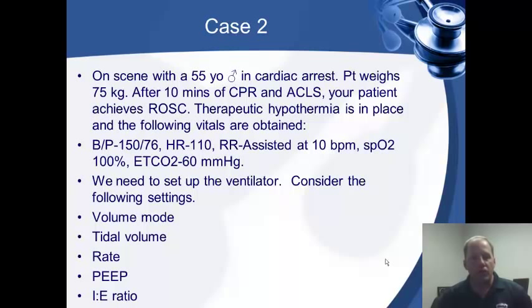We're going to choose volume mode. We're going to set that tidal volume based on that 75 kilograms, and then we're going to set our rate probably at about a rate of 16. We're going to try to get that CO2 to come down so the patient's not so acidotic. We can use about 3 to 5 on PEEP, and we've got to set our IE ratio.